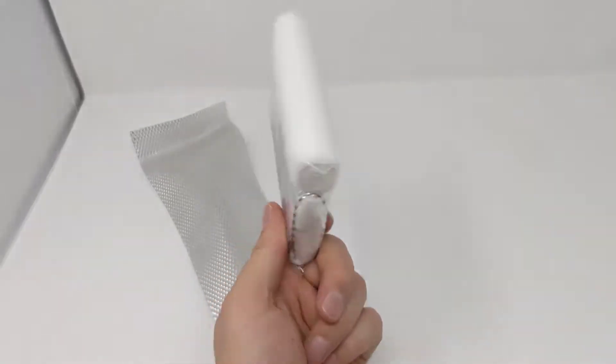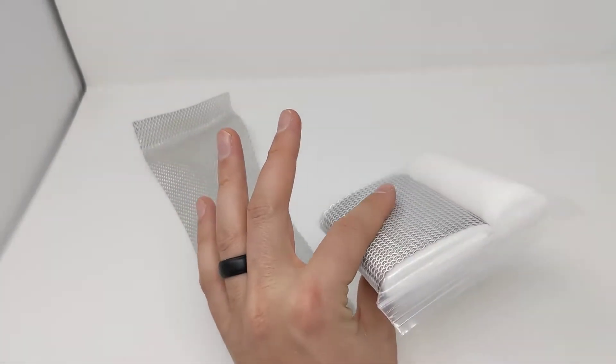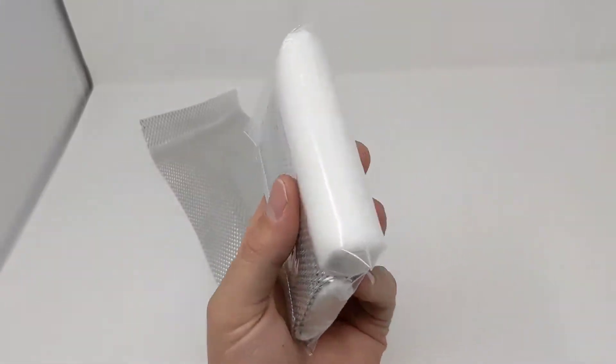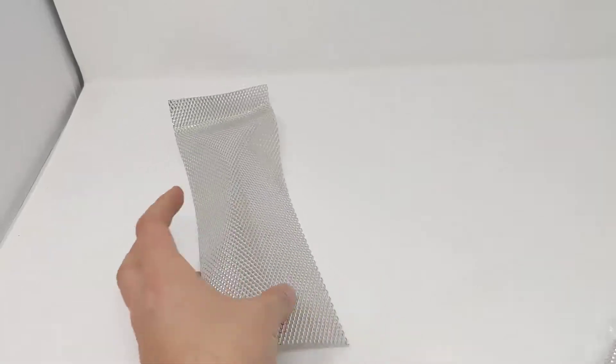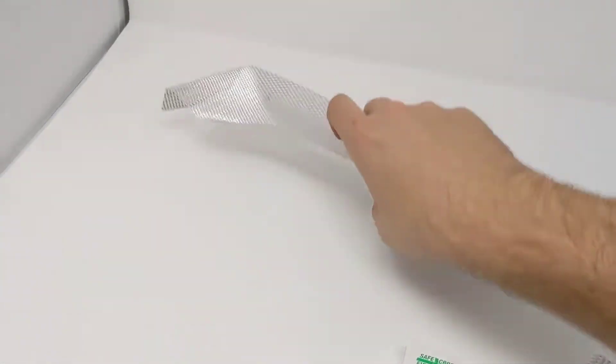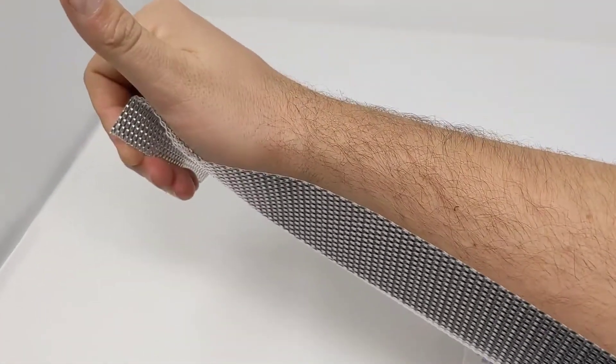The advantage for ultralight backpackers, hikers, or someone that wants a smaller version of the go-to SAM splint — this would be a good alternate. They can again be molded just like the SAM splint, so you can mold it to the injury to make it kind of a custom fit.